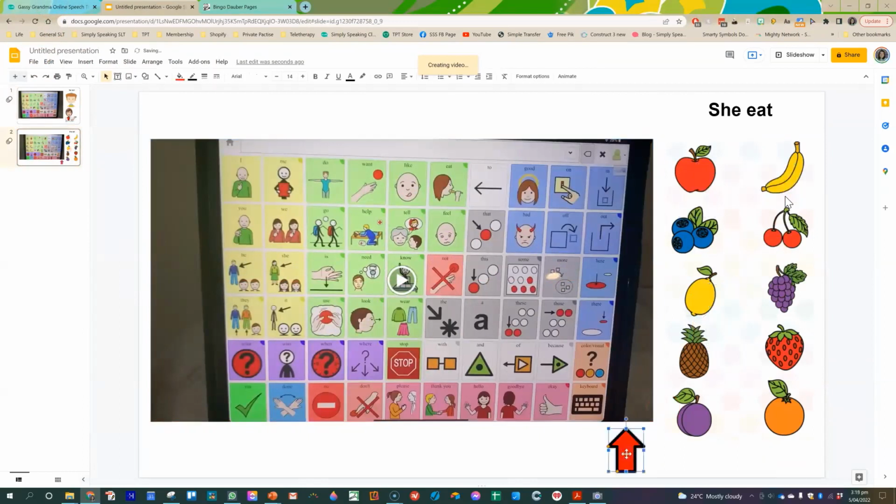Now again, remember, for activities like this, if you can share your screen and share your mouse controls with your students, it's nice for them because they can move this around. I'm not sure if I've mentioned this already, but my preference is students to be on a laptop for teletherapy sessions. It's just easier, there's more capabilities, and you're working against less limitations.